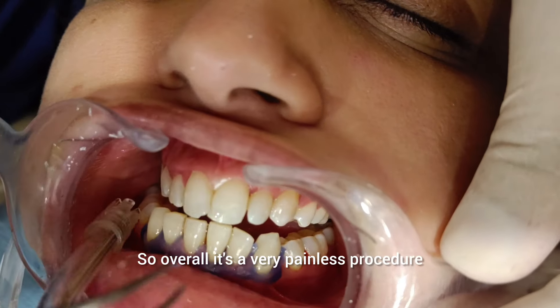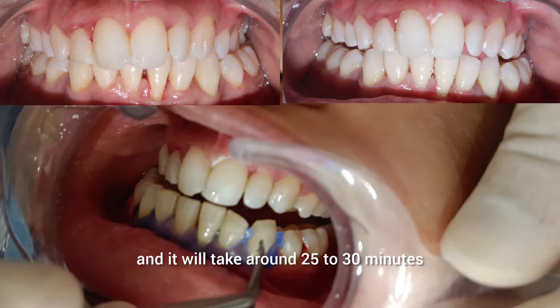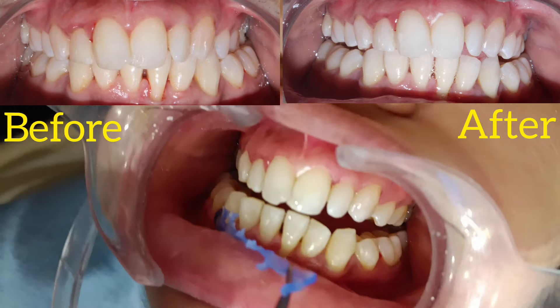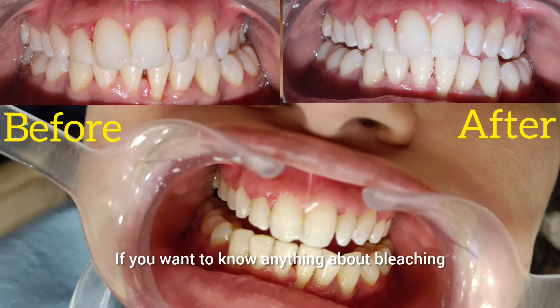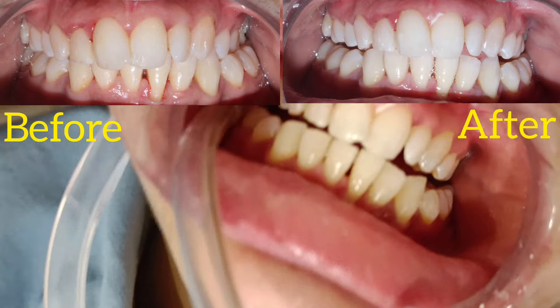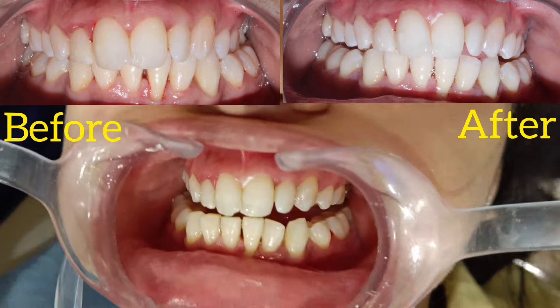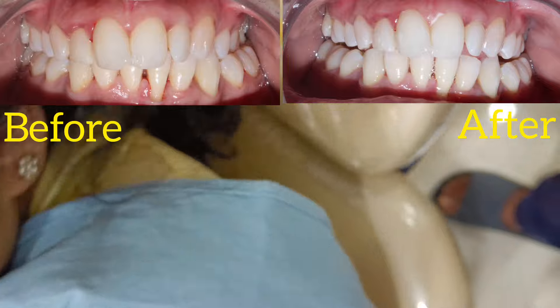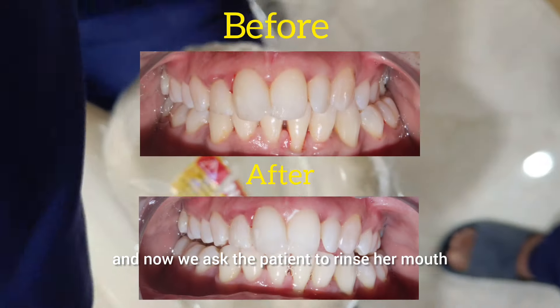Overall, it's a very painless procedure and it will take around 25 to 30 minutes for a full appointment. If you want to know anything about bleaching, comment in the comment section below and do follow us. So this is us doing a bleaching — now the cheek retractor is off and we ask the patient to rinse her mouth.